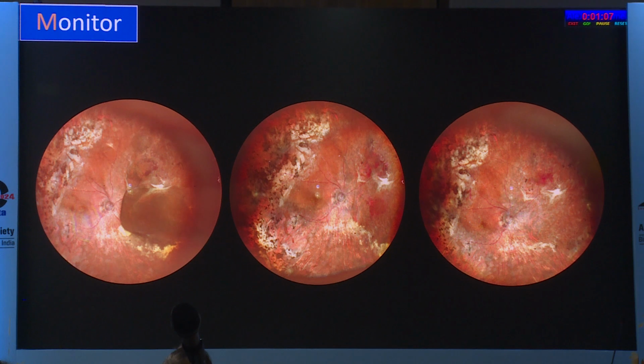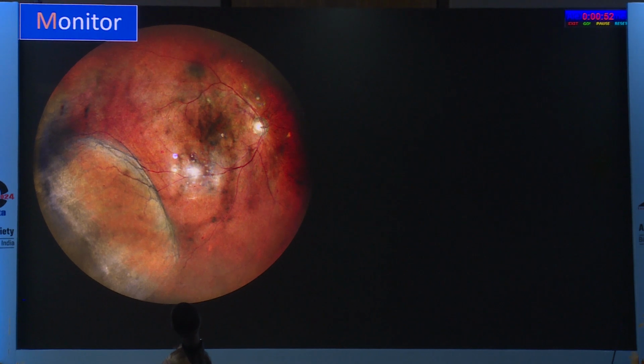patient. We know fundus fluorescein angiography might help in this situation, but you cannot keep doing fundus fluorescein angiography every time you have a doubt. So many times, wide field color fundus imaging comes to the rescue, but it cannot replace wide field fundus fluorescein angiography.